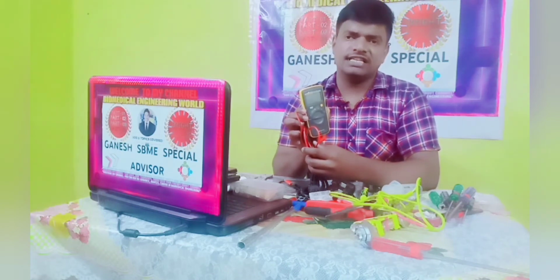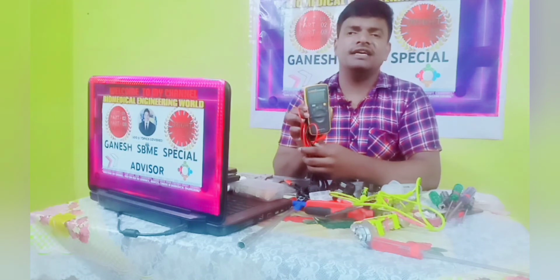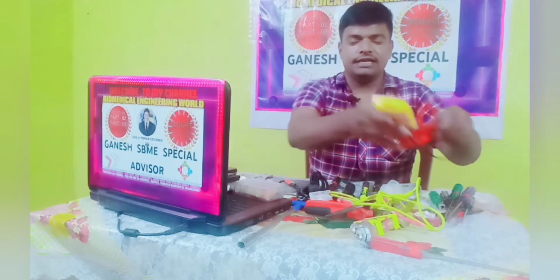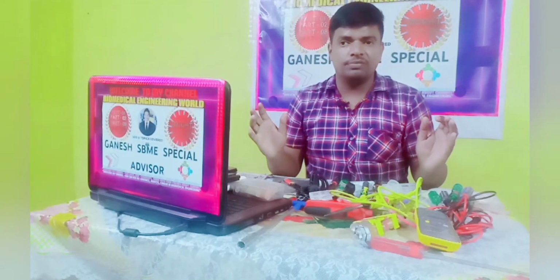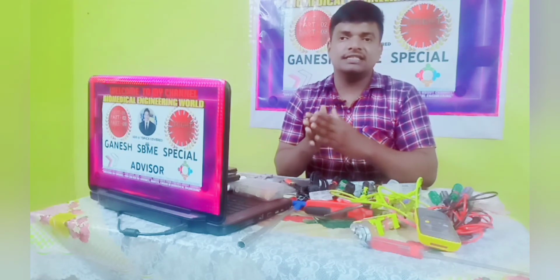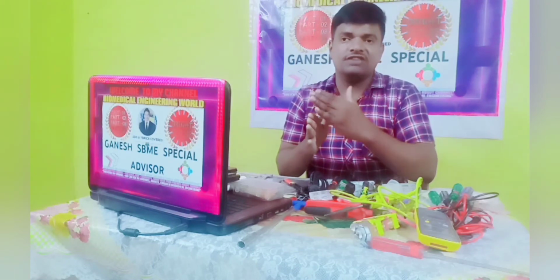So the power supply board, display board and control board, whatever boards the equipment has, many components are available inside. For those components we need to check and find the problem and resolve it. What are the basic requirements to service the equipment? Yes friends, thank you. I hope you can understand. These are the main basic tools. Actually, as a biomedical engineer, many big tools are also available, like the calibration kit and PPM kit, but these are scheduled quarterly, half yearly or yearly, depending on the service.